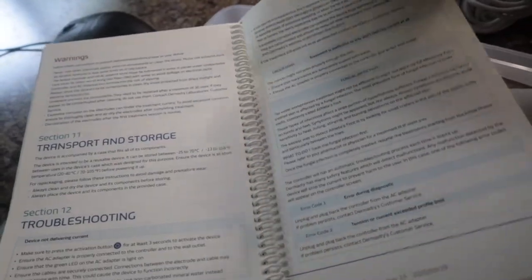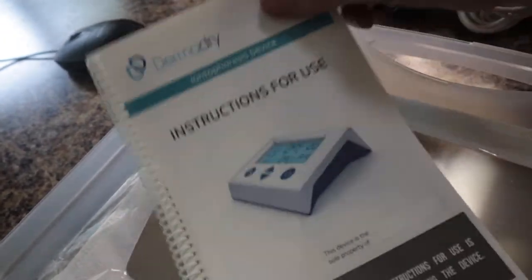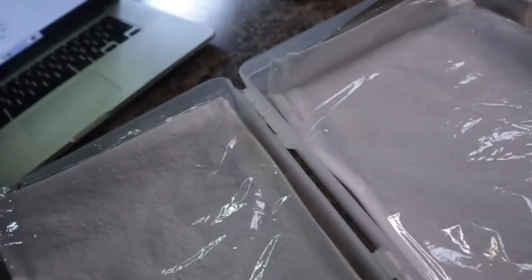I'm noticing the manual is all in English. Parts of the box were in French but I don't see a French manual — I don't know if you can request that. These are the plates. The plates go down into here and then you plug in the wire right there that goes to the machine — that's how it does the treatments. There's one for each hand or one for each foot. And then you have the pad on here, which goes on top and you just add water to it once you get going.